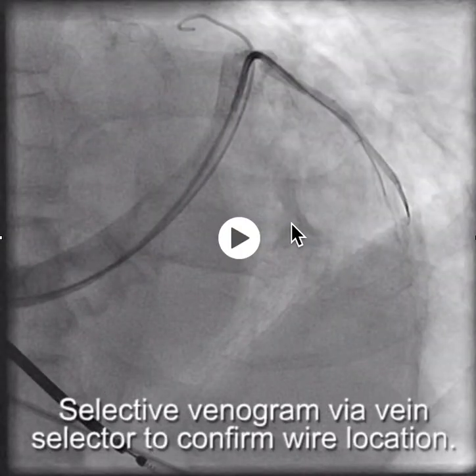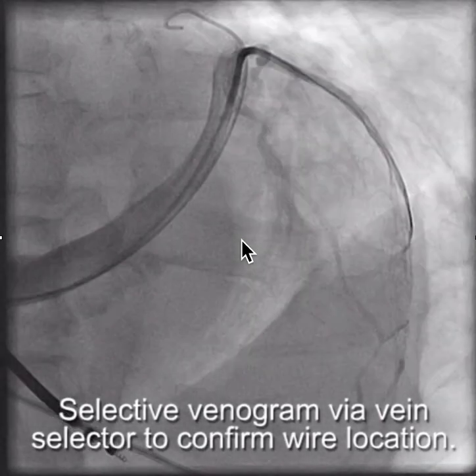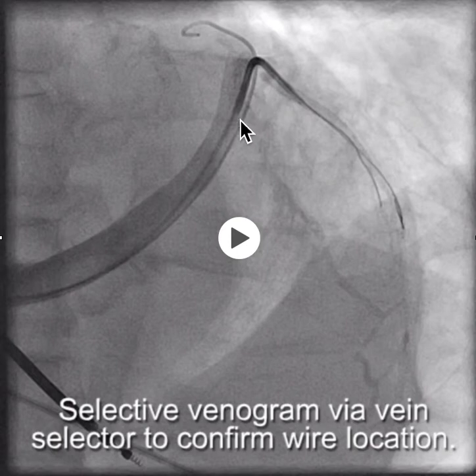From here, we'll do a selective venogram with the vein selector to confirm that we're actually in the branch that we want to be in, and also look for any other branches that might be suitable. We didn't see any other suitable branches except for this one, which really had a terrible takeoff.